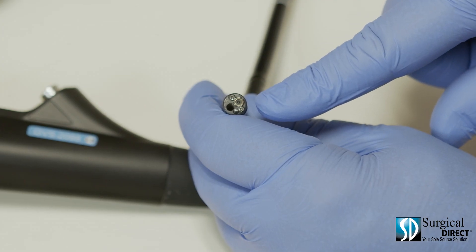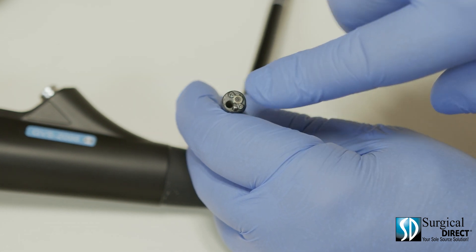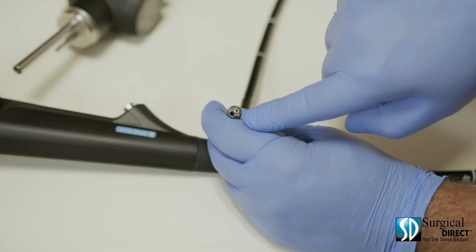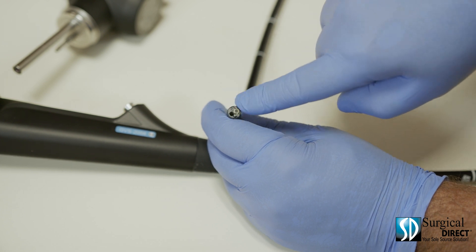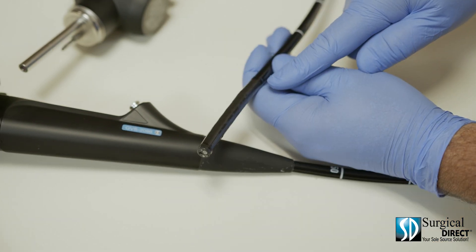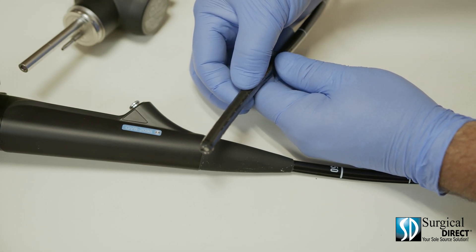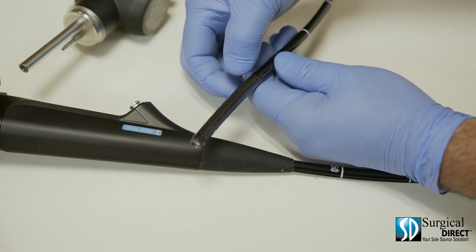This is the distal end of the scope. It has a plastic seat cover, a water director, a lens, and two light outlets. Damage can be easily done to any portion of this scope by allowing it to hit the hard ground. This is the bending rubber section of the scope — a soft piece of rubber that allows the scope to bend at the tip. This portion can easily be damaged by a sharp instrument or an animal's tooth.